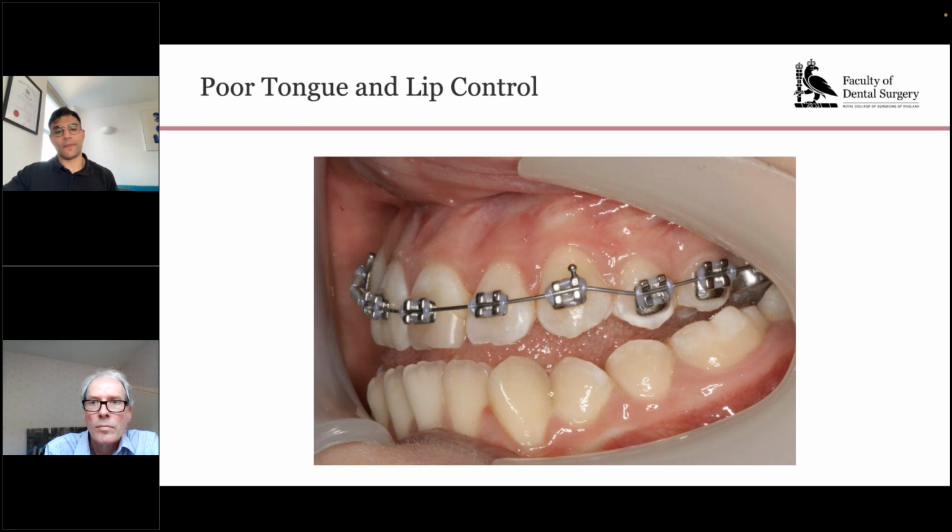Okay, thank you. Nuraini Mohammed Noor has asked, how do you take a picture of a lesion, for example, an ulcer? Well, I would say that you take a picture of a lesion in the same way that you take a picture of anything else intraorally, and that is you want to have it dry, you want to have it in focus.